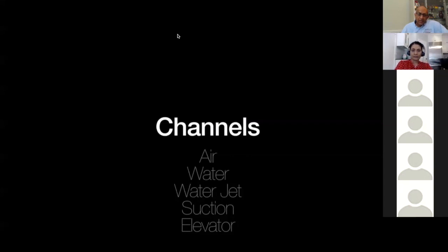So when it comes to channels, there's not one channel, there are a lot of channels. You have channels for air, you have channels for water to clean the lens, you have a channel to clean the lumen, that's a water jet, and you have a channel for suction of both air and contents of the gut.